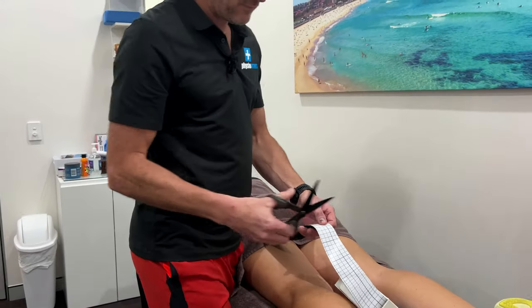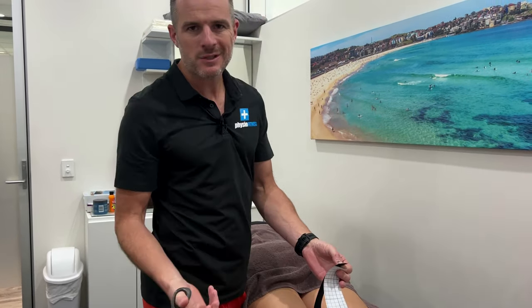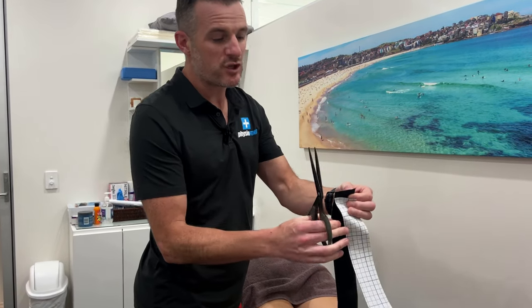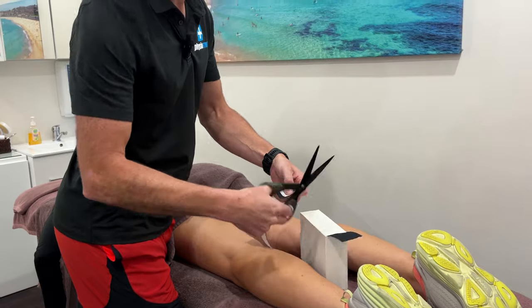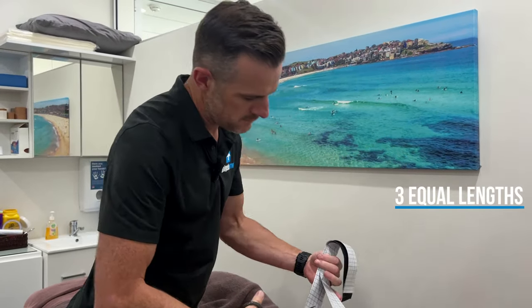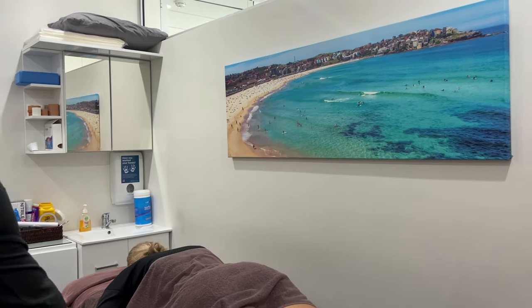I'm going to show you doing it with three tapes. Think hamstrings — there are three hamstrings, tape three times. That's two medial and one lateral. So measure one, cut three times, and then you've got your three hamstrings. It doesn't have to be absolutely exact, but pretty much the same length.